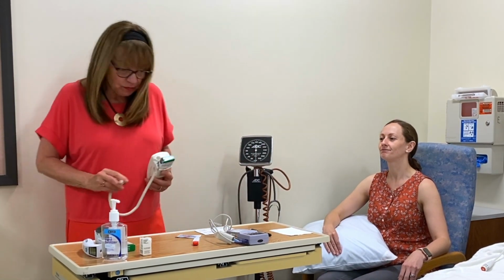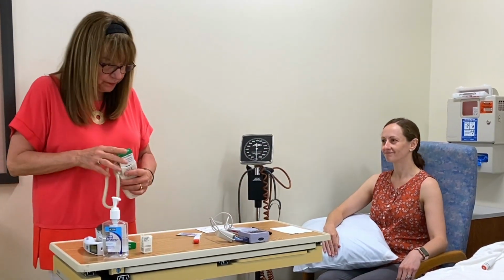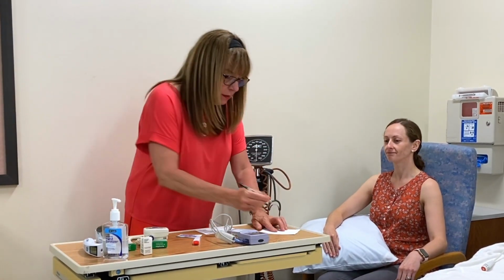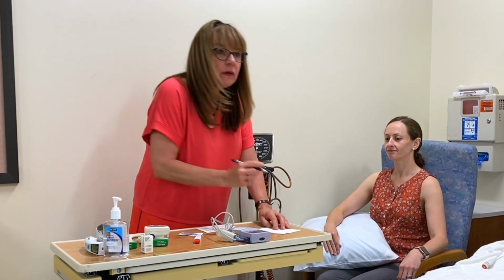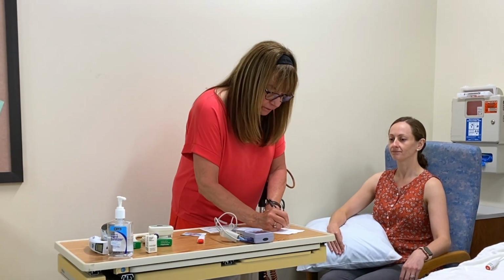Monique's temperature this morning is 98.2. 98.2 is normal. Oral, 98.6. Axillary, 97.6, the average normal. Rectally, 99.6. So this is a normal temperature.